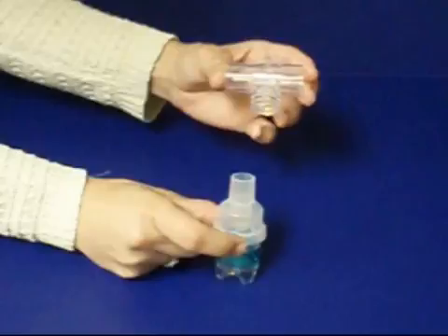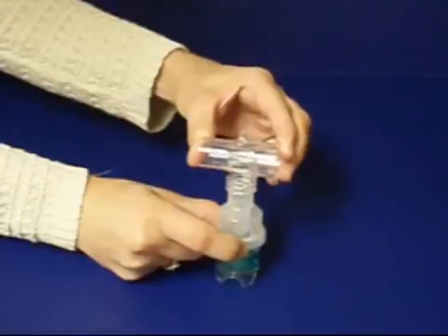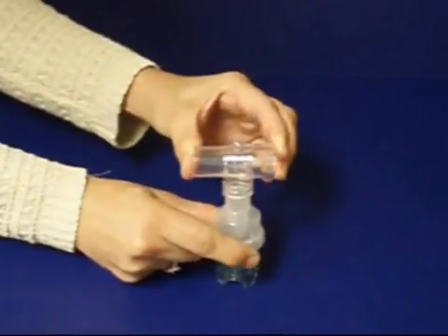If you are planning to use a mouthpiece to take your aerosol treatment, first, attach the T adapter to the nebulizer by inserting the outlet on the top of the nebulizer to the inlet port on the T adapter. This is the opening with 3 plastic rings. Now, slide the T adapter firmly onto the nebulizer.